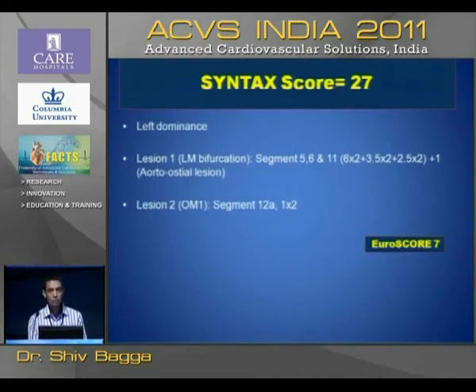So I initially referred this patient for surgery only, but the surgeons actually refused, considering the high risk. And in addition, the patient's attendants were also not willing, although we usually take it as a convenience score rather than SYNTAX score for justifying left main bifurcation stentings.